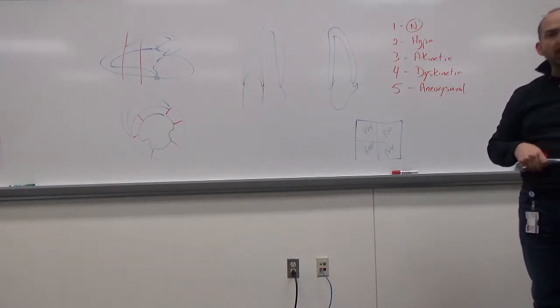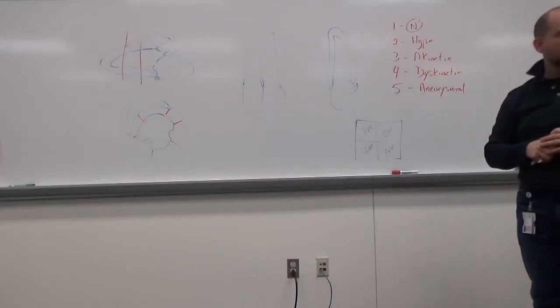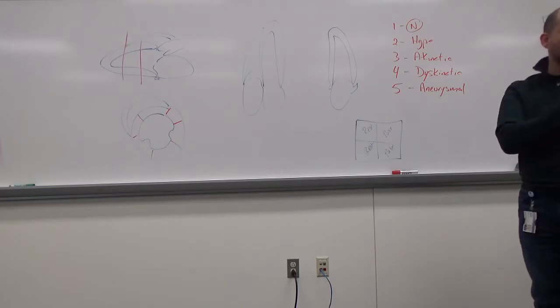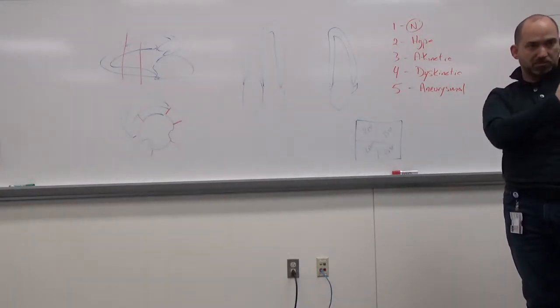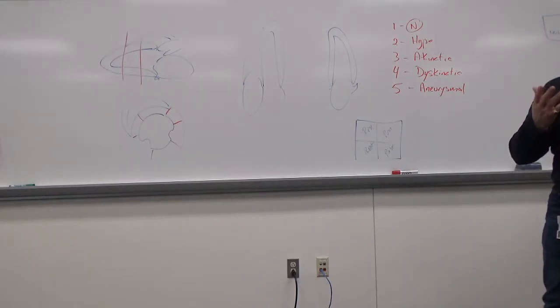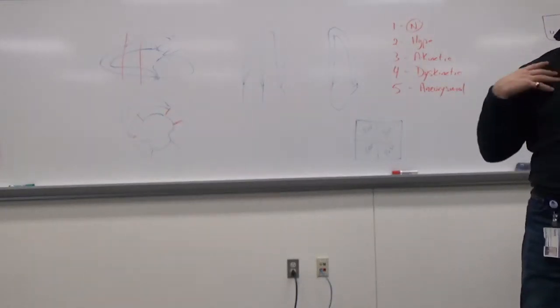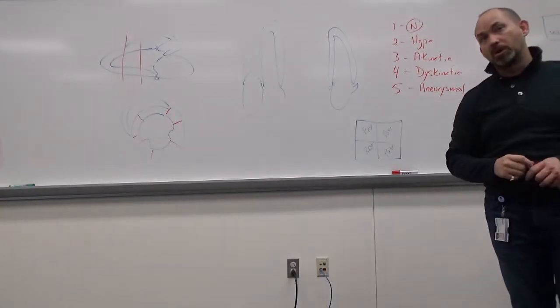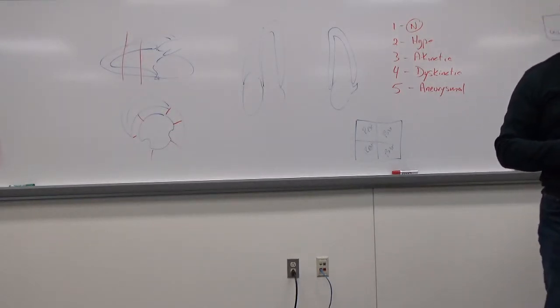Okay? Has anybody seen people that have had pacemakers implanted? Yeah. Okay? So they've got this thing, it's like a box that's right underneath the skin. So you get the skin line, you get this big bulge that comes out in a very abnormal looking way, it's not a natural thing. So it's fairly obvious that they got one. It's almost always on the left side. It could be on the right side, but it'll be pretty obvious when you're setting up for the exam that they've got it, and they'll probably tell you anyway.